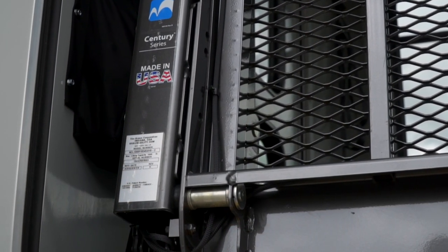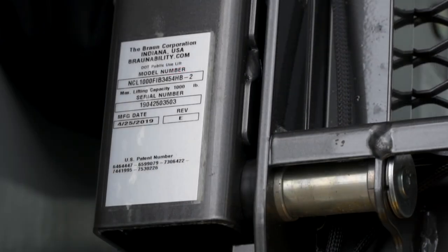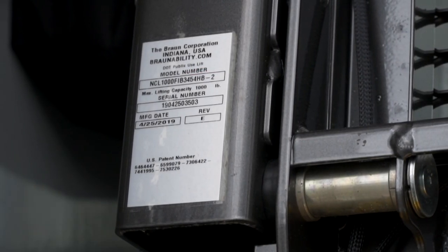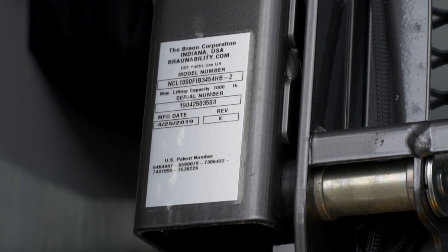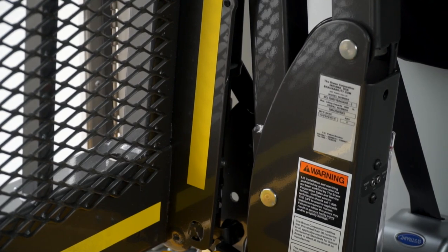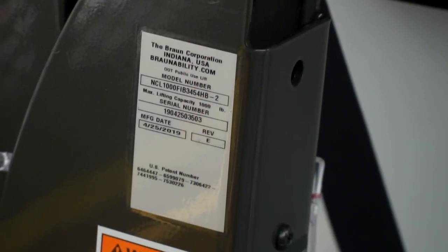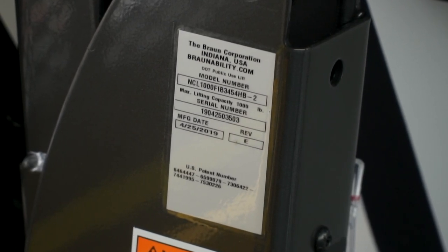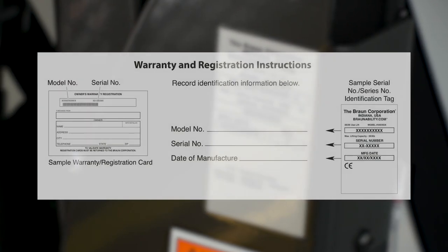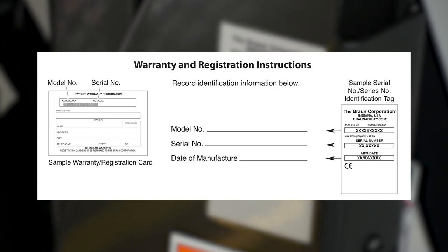Make note that there are two BraunAbility model and serial identification tags on your lift. One ID tag is located on the opposite pump side vertical arm and the second is located on the opposite pump side tower. You'll also use these numbers if you need to file a claim or order parts in the future, so we recommend that you record this information in your operator's manual for easy access.